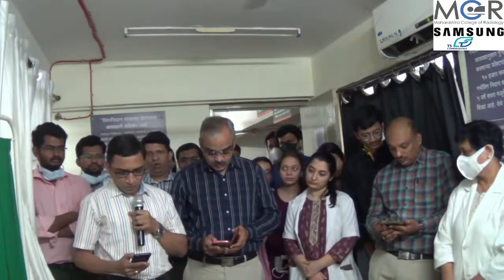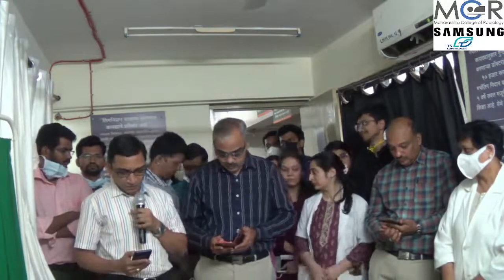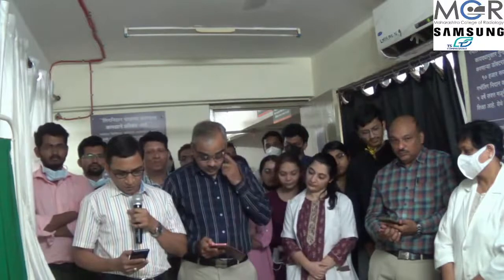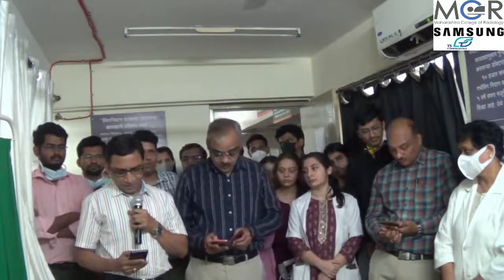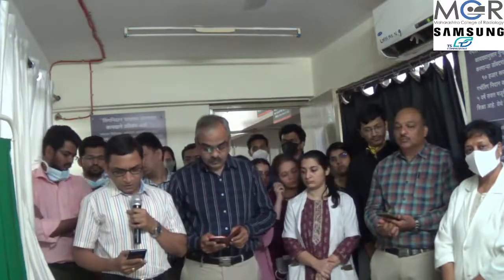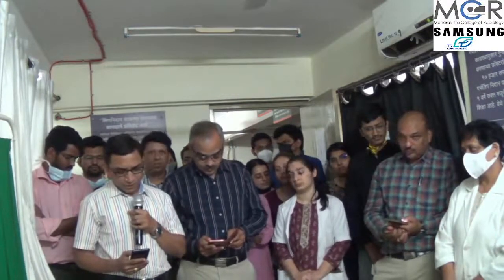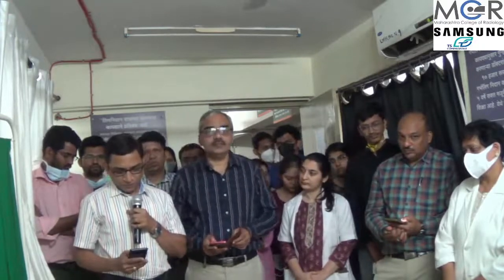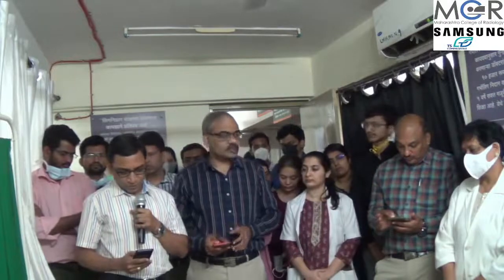Next question is, how to search for ovaries on abdominal USG which are devoid of dominant follicles in case of a child of less than 10 years in a suspected case of ambiguity or Turner syndrome who has not yet undergone any genetic testing, especially when ovaries are small and follicles are being confused with bowel artifacts. Now in a 10-year-old child, it is very difficult to locate the ovaries on transabdominal sonography. So naturally MRI would be the modality of choice in this case. T2 weighted MRI pelvis is the best modality, and it also demonstrates the follicles, even if the follicle size is small, up to 1 millimeter. So MRI would be a better choice in this case.